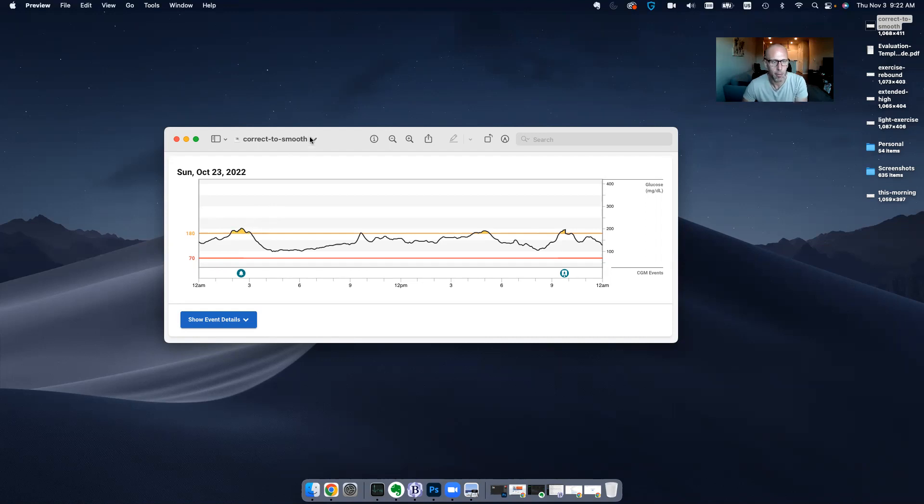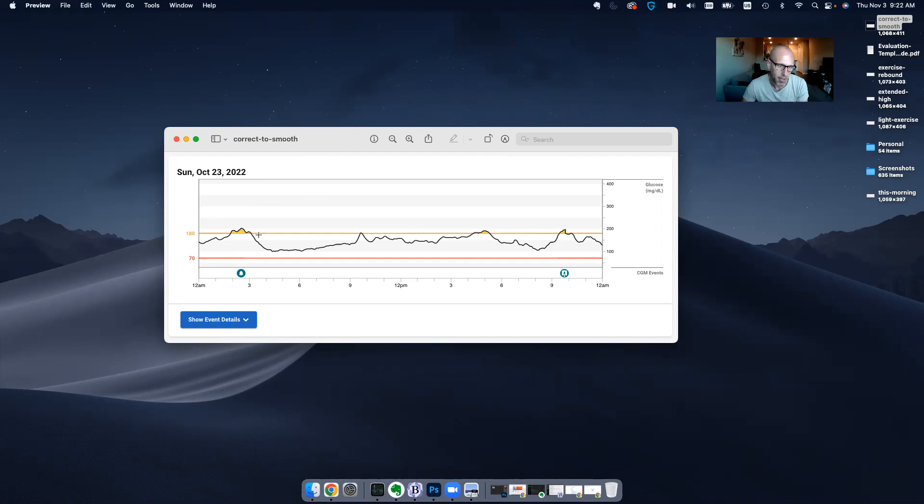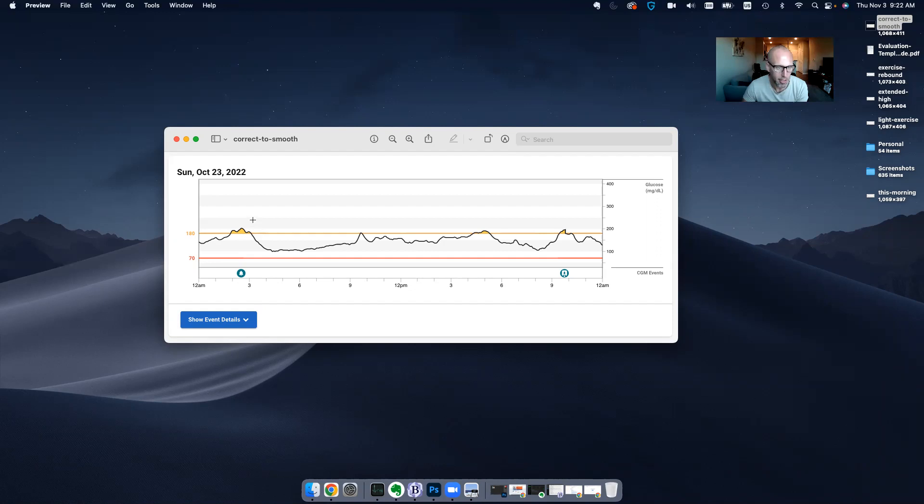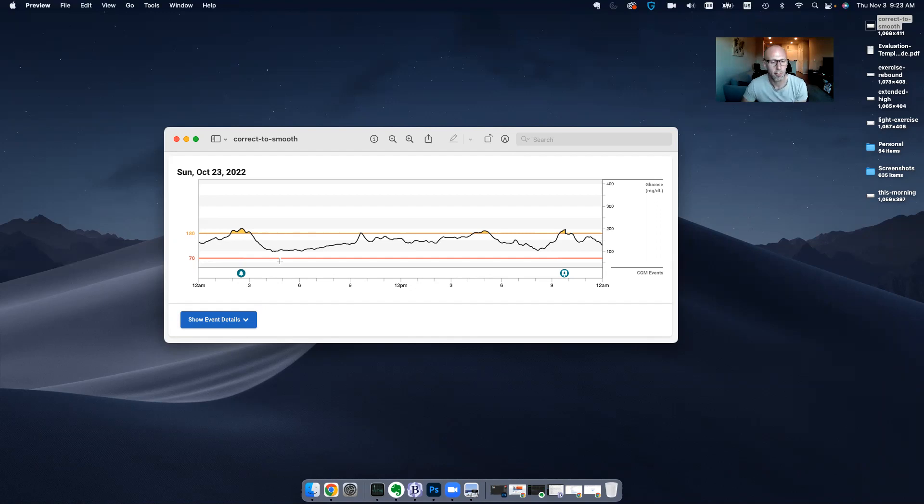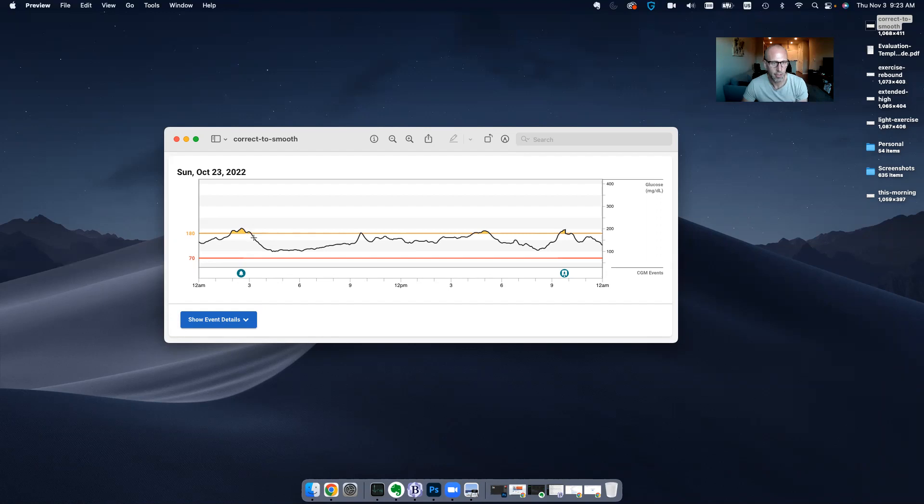Now, the cool thing about the Omnipod 5 is that the fact that it adjusts the amount of basal insulin that you get, this might have been actually a crash downward if I was on MDI, because a lot of times if I take a relatively large dose, especially at night, once it starts moving, the momentum is just going to keep pulling it down. So this is a great example of it was high, I did a manual correction, it came down, but then you can see that it's smoothed out. Because the Omnipod likes these sort of straight lines, the algorithm does. And so it knew once coming down at a certain rate to stop giving me those background adjustments. And now I'm nice and smooth. So an example of, in this case, I really wanted to give myself a correction and then I ended up in a nice, good range.